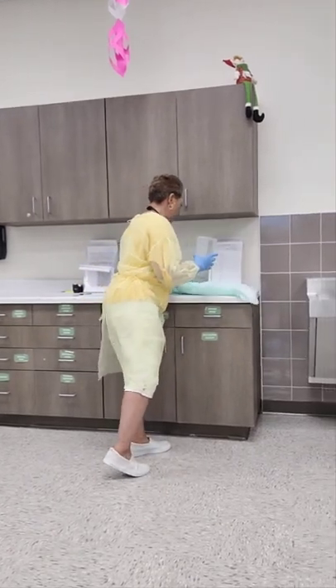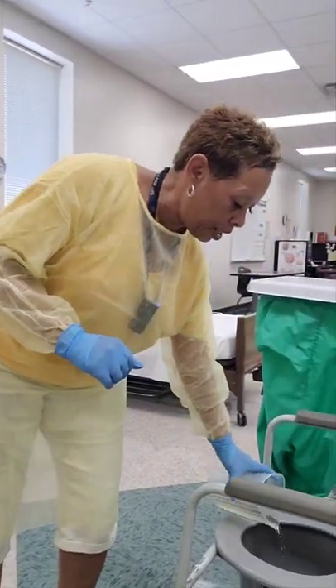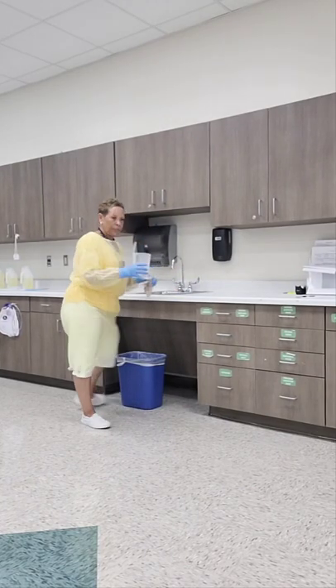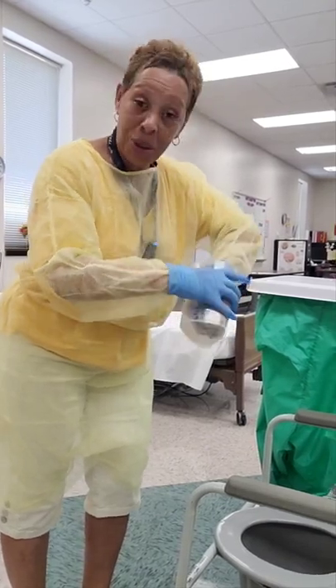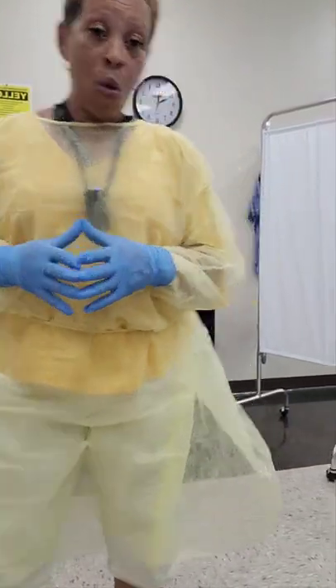Now I'm going to collect my clean barrier and dispose of it into the waste bin. Then I'm going to empty the contents of the graduate into the bedside commode or toilet, making sure it does not splatter. Then I'm going to rinse the container, empty the rinse into the bedside commode or toilet again making sure it does not splatter. Then I'm going to dry the measuring container and replace it back in storage. At this time, I'm going to go record my measurement.